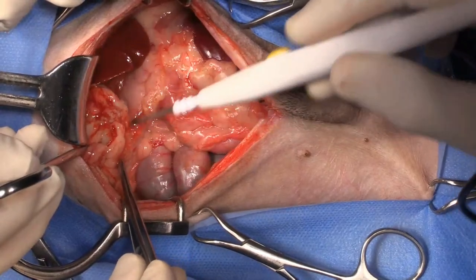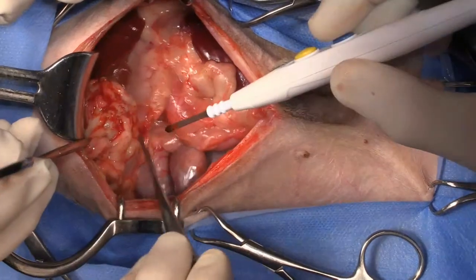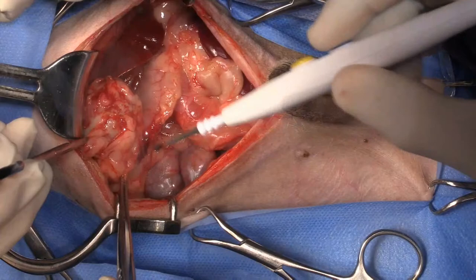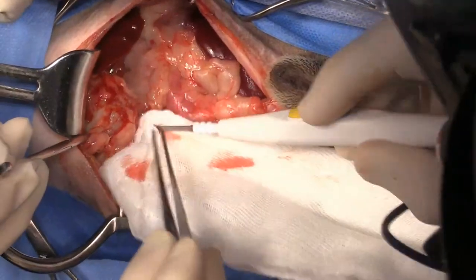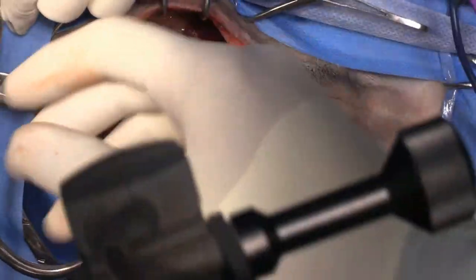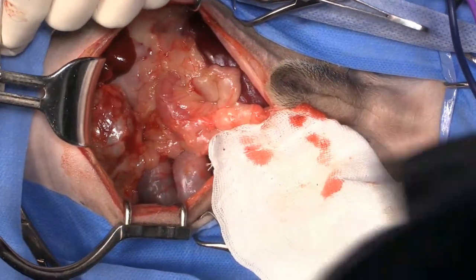So we've got really pronounced adhesion even between the stomach and the gallbladder. Yeah, that's weird. It's had a previous rupture? It had some ascites before. You'd think of it, did it have like a bile, at least a focal bile peritonitis? Yeah.